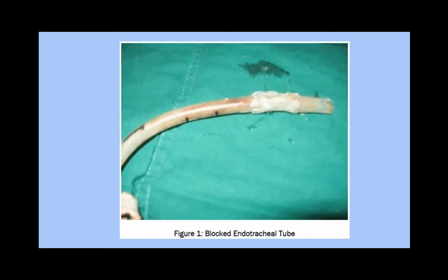And I encourage all of you, when you're in the MICU, learn to use the inline suctions. To me, that is bread and butter ICU, because you have to get used to the feeling of how deep a suction can go. That's going to teach you whether this is normal or abnormal. But if you have no experience whatsoever using one, you are going to have no idea: is this deep enough, is this too shallow, is it normal, is it abnormal? So you have to do these things very regularly to get that feeling and that muscle memory. That's one of the very cool things that critical care gives you, muscle memory on many things that are part of the medical care of the patient.